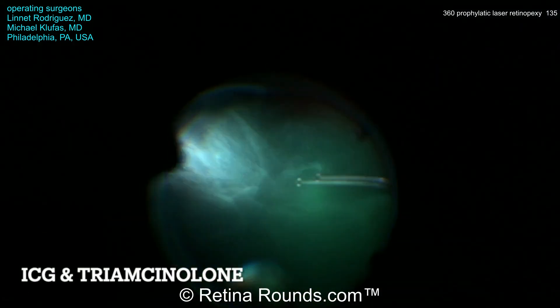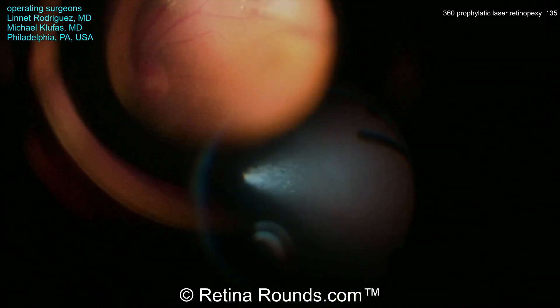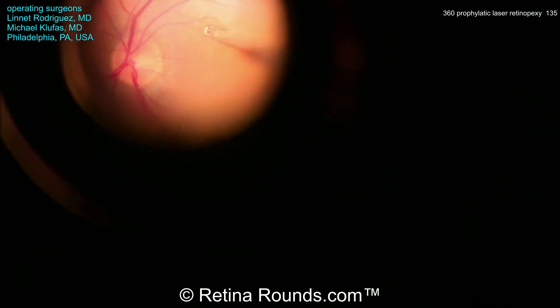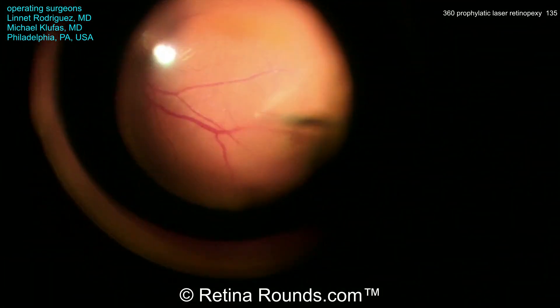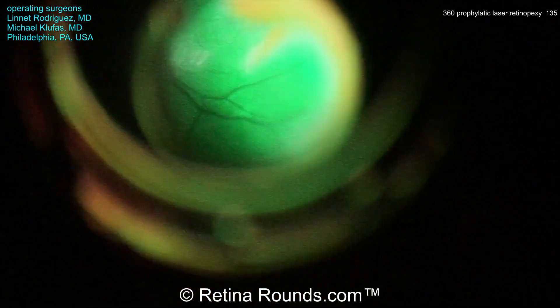Now some ICG as well as some triamcinolone are instilled over the posterior pole, and using a high-magnification contact lens, you can see this epiretinal membrane that's very nicely being peeled from the macular surface. The ERM has been peeled first over the nasal macula, and now the peel is being extended over the temporal macula.